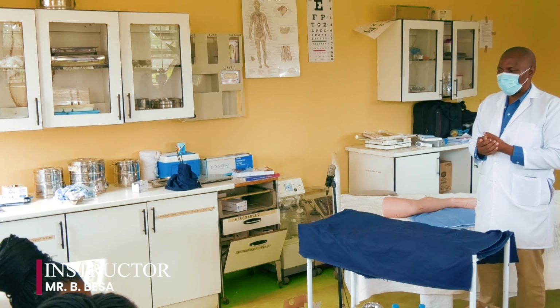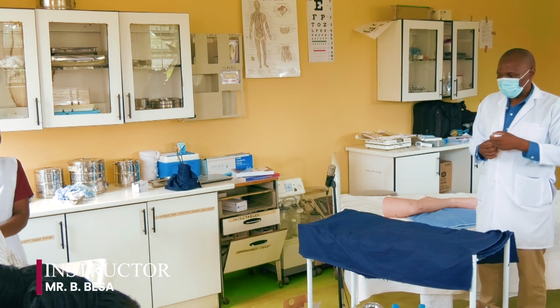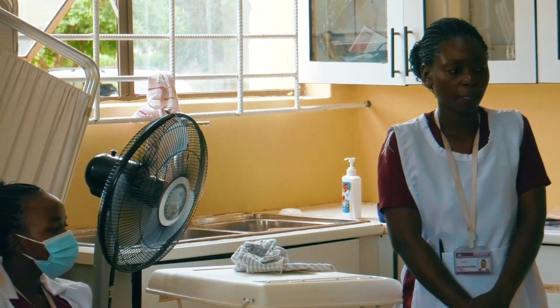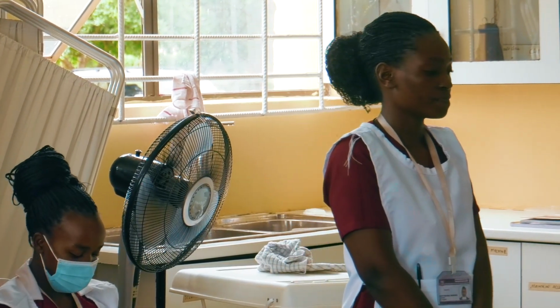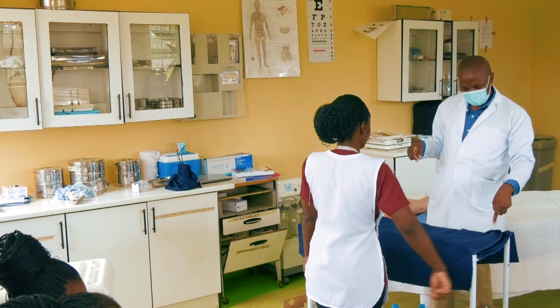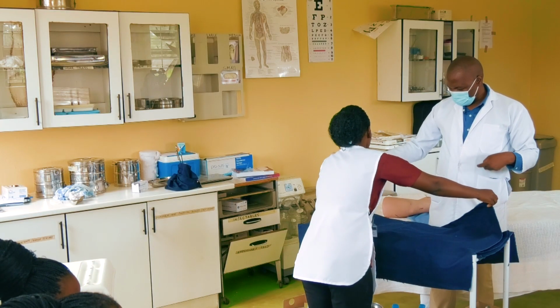You should have your own hand towel. It should just be here. Forgot your plan? Okay, so use this. She will stand this side. Since this is covered, hold this corner here. No, stand here in the middle. One hand holds this corner, the other one this one. Then the other one here. Then lift.